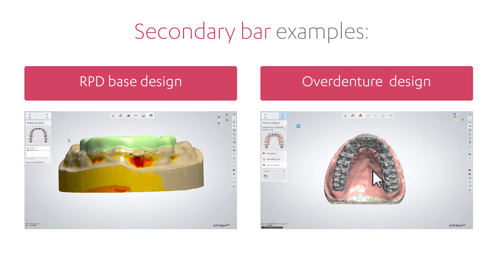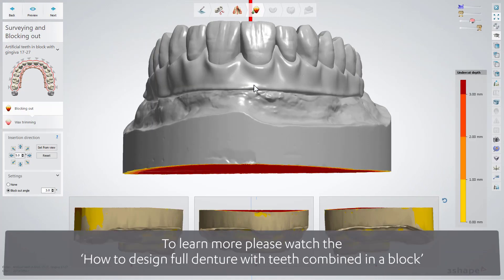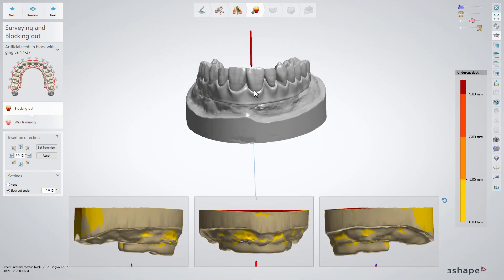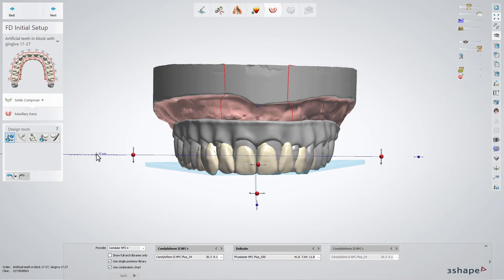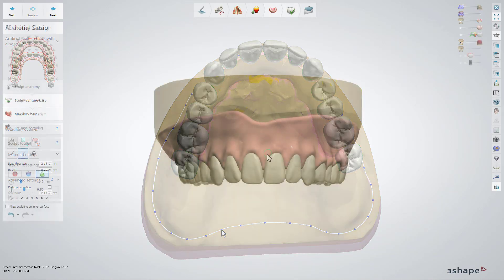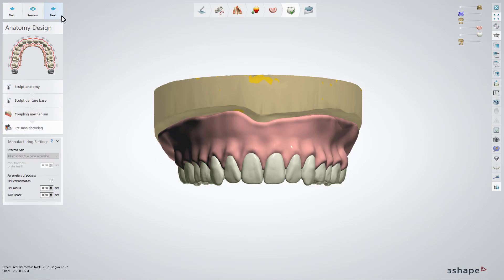Use the Copy and Append option again and start designing the denture with the RPD base. Start with analyzing the model, defining the occlusal plane, and setting the characteristic points for both jaws. In the Surveying and Blocking Out step, check the insertion direction and set it if needed. Further on, position the teeth in the correct place according to the opposite jaw with the help of the design tools, and move further to design the base for the denture. Move to the anatomy design step, sculpt the designs, and set the parameters needed for the coupling mechanism and for the base connection. When you are ready, move to the Save step.